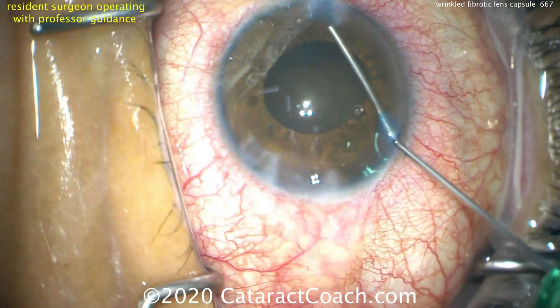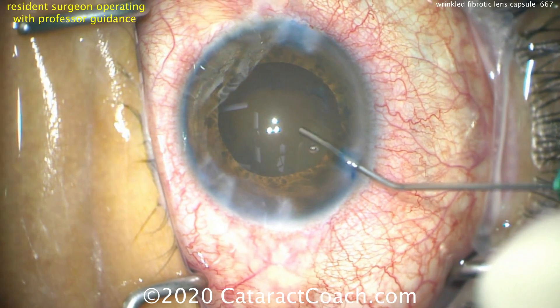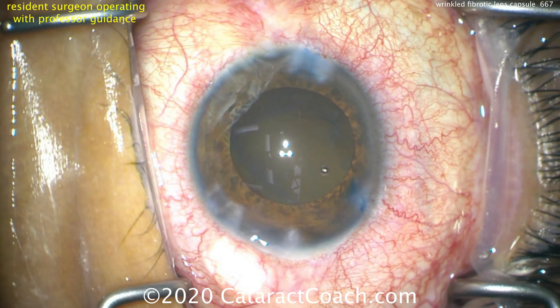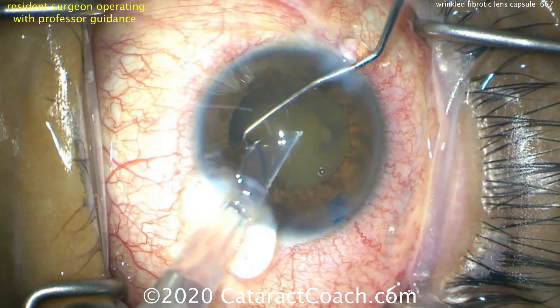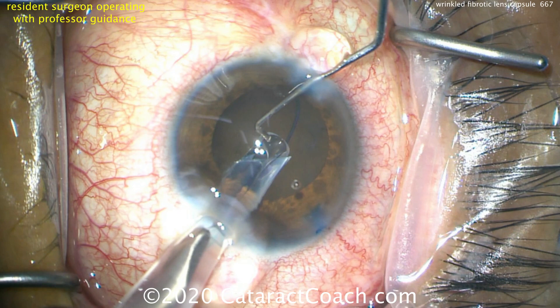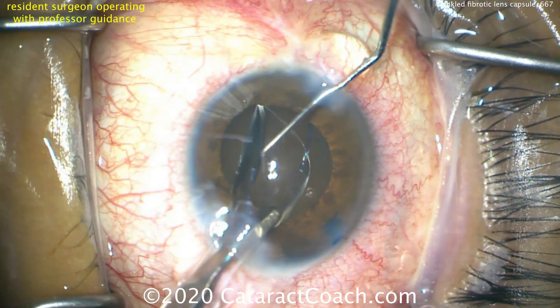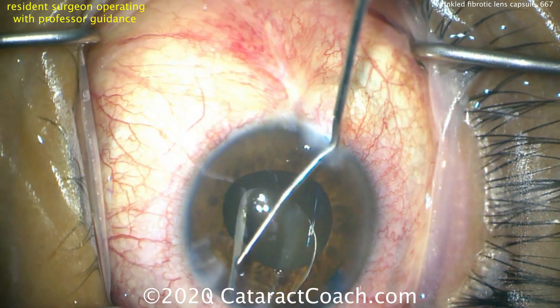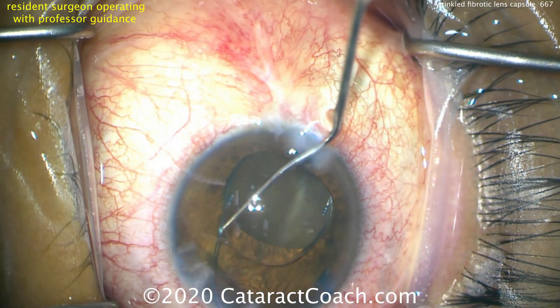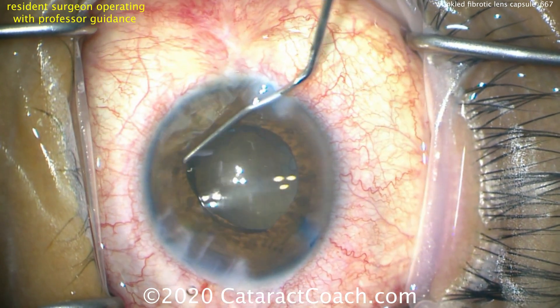Fortunately in this case we're safe. A little more viscoelastic going in — getting a nice good fill with this cohesive viscoelastic. As we expand the capsular bag and open the pupil you can see the outline of our capsular opening right up against the pupil margin. In this case a three-piece lens — could you put a single-piece lens? For sure. We're going to put a three-piece lens trying to place it 100% within the capsular bag. If the capsular bag is irregular and there is some issue, we can always put this three-piece lens into the sulcus. If you start off with a three-piece lens and it doesn't go as planned, you can always dial it into the sulcus and do a different form of optic capture.